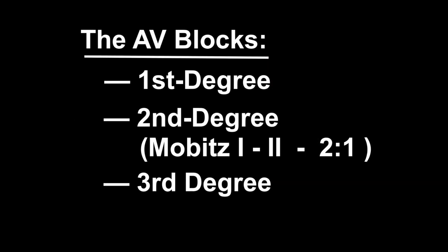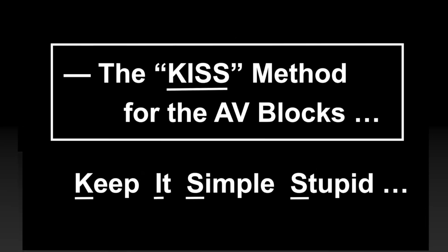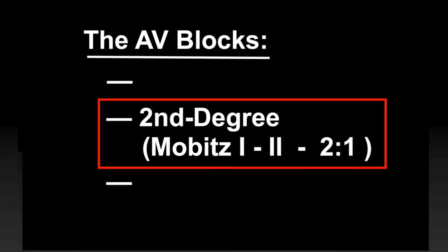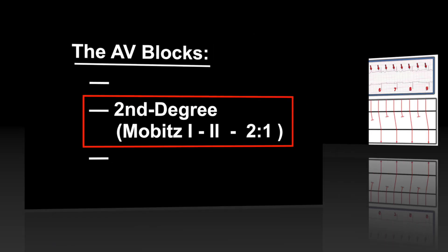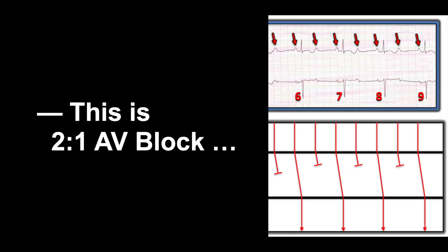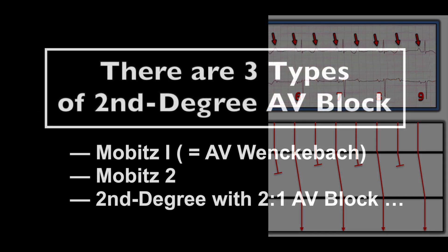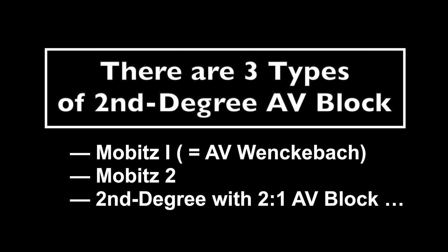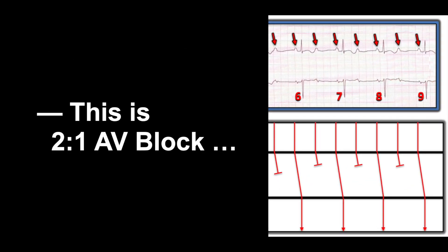What degree is it? Is it first degree? No — because not every P wave is conducting. Is it third degree? No — because some P waves are conducting. Therefore, by the KISS method, this is a type of second-degree block. This is the special type of second-degree AV block because there is two-to-one conduction. With Wenckebach, the PR interval progressively increases until you drop a beat. The problem is with two-to-one conduction — one beat conducted then dropped — P waves never have a chance to increase the PR interval, which is why we cannot be sure which type we have. But we do have a second-degree AV block.